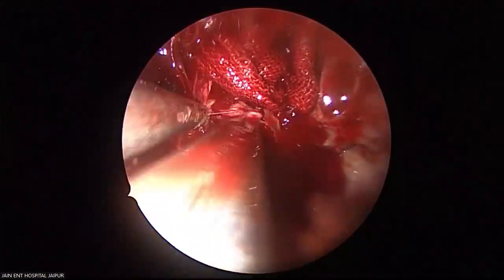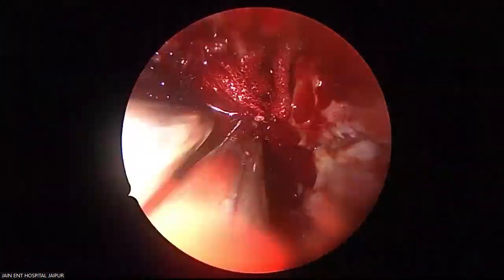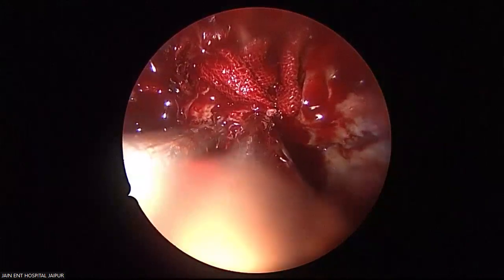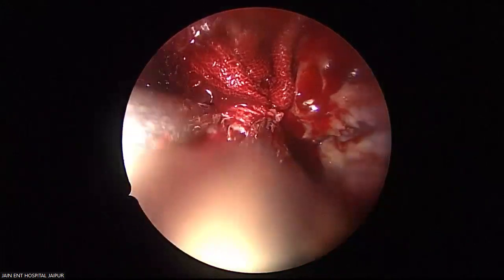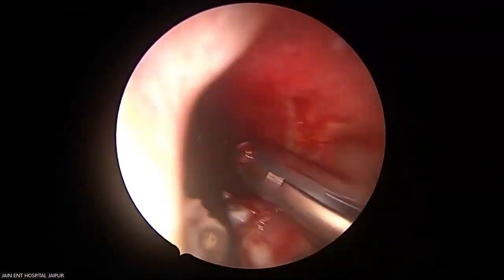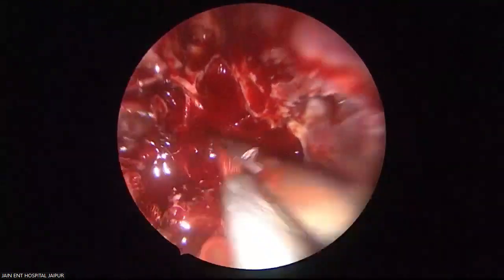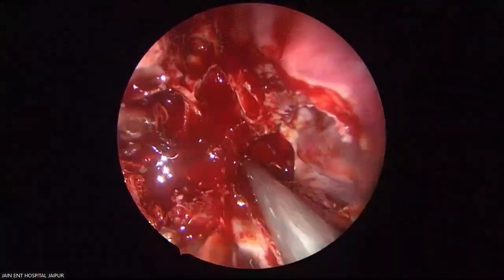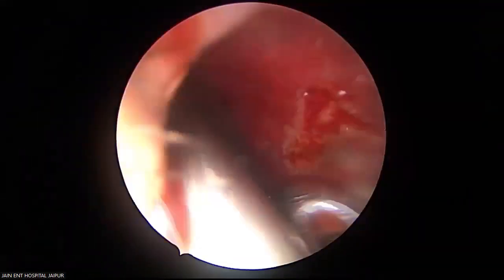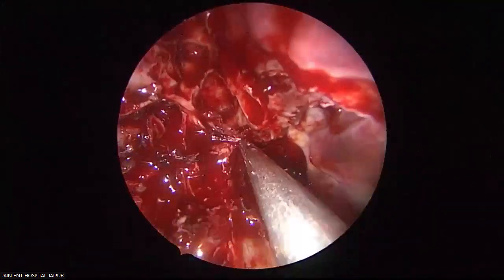See, in the cancellous bone, see the bone underneath. See how it comes out. It has to be a pull, pointed out. I'll tell you how to pull. It should be a controlled pull. Let the bleeding come. Don't pack so easily, because we don't want to pack the tumor.